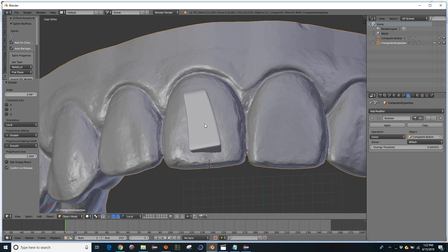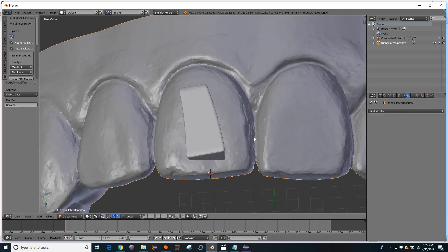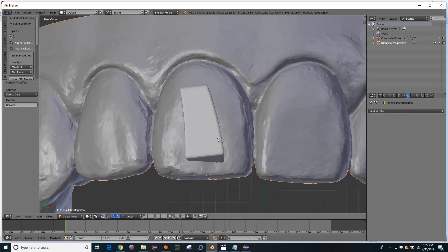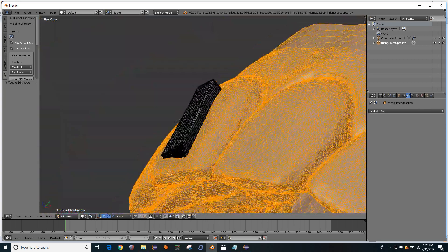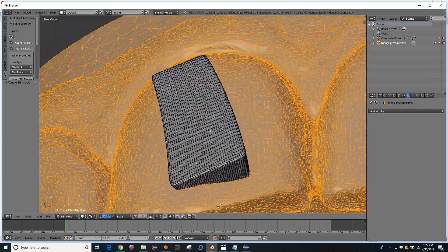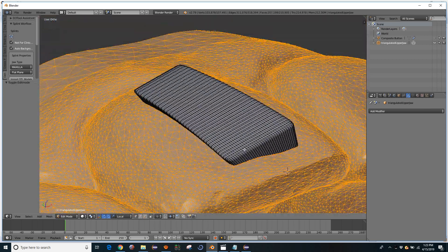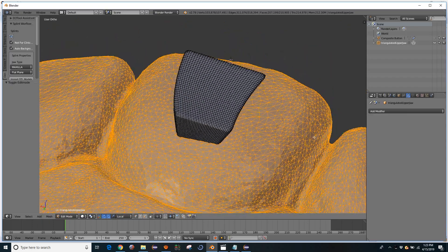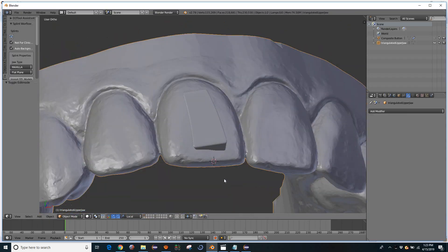So when you have it exactly like you like it, you can apply. And now these two objects are permanently joined. You know, this has actually modified the data of the original object.